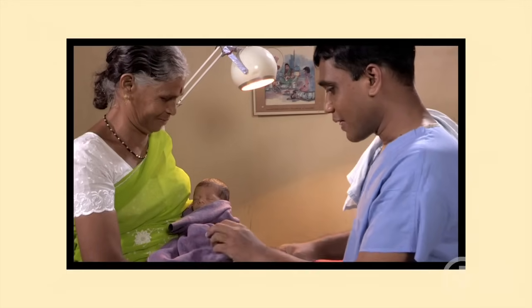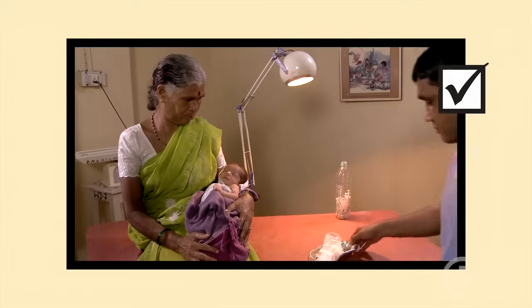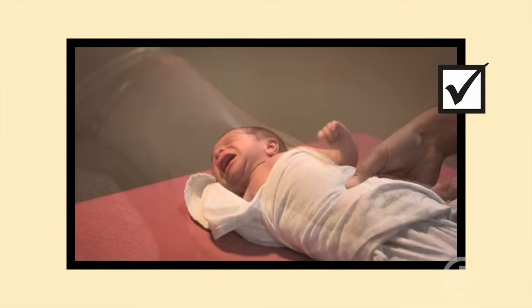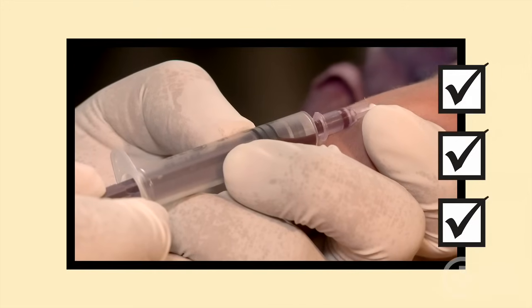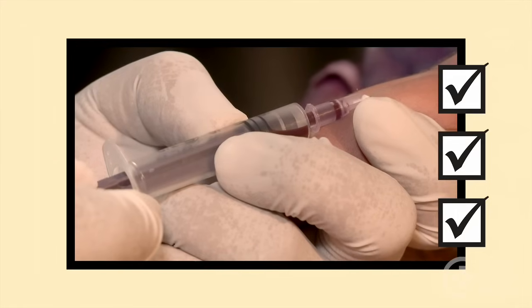Remember: before you start, inform the caregiver, gather all your supplies, and wrap the baby snugly. Take a shallow approach with the needle and be patient with the baby's tiny veins. A slight pull on a syringe brings the blood.